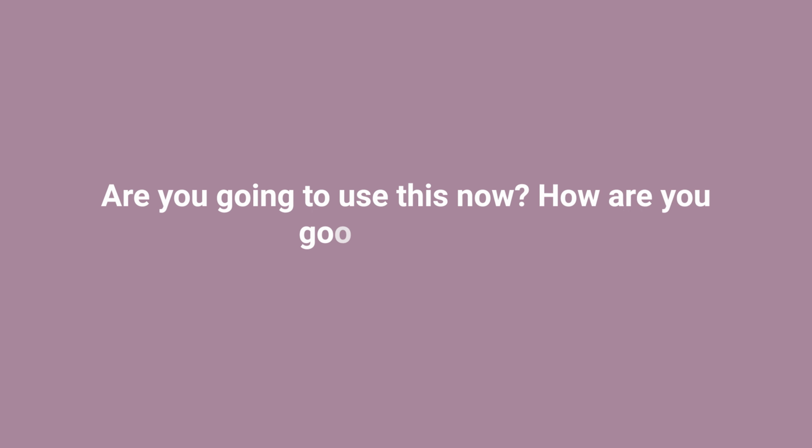I know it was in the framework of a grant that you had. Are you going to be using this now? A year of your work. Are you going to be using it? And how are you going to be using it? Yeah, I hope you will be. Great question. Yeah, what was the end game?